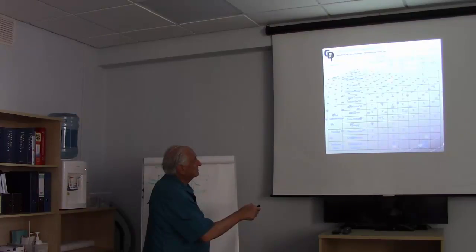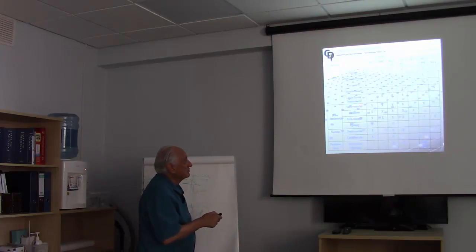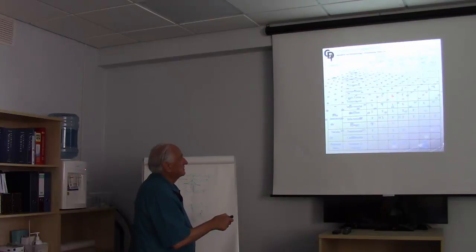Thoracolumbar, same kind of idea, but lumbosacral, EMGs. You might use upper extremity evoked potentials to protect the brachial plexus for positioning issues. Lower extremity SEPs to protect the spinal cord and nerve roots. You might use D waves. This is for an intramedullary tumor. You might use D waves to protect the spinal cord. Cauda equina tethered cord, EMGs. Again, upper extremity evoked potentials for positioning issues, and lower extremity evoked potentials.